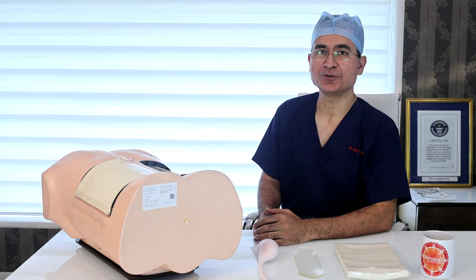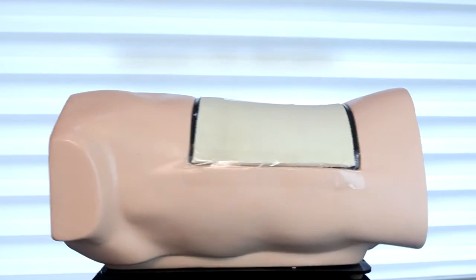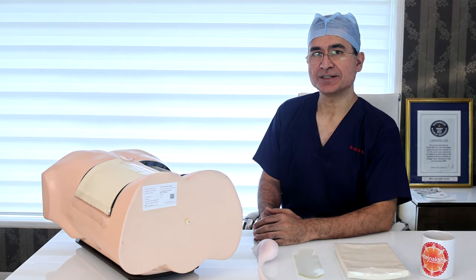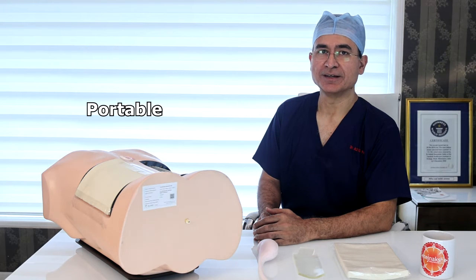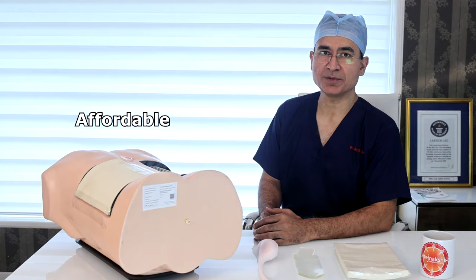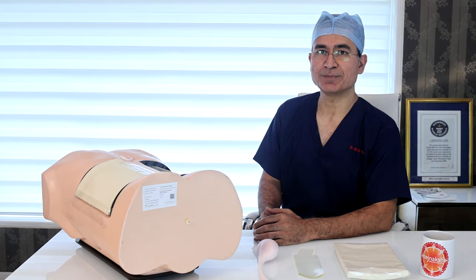Hello, we are happy to show you our personal PCNL simulator, specially developed for puncture training under fluoroscopy. The advantages of this surgical trainer is its portability. The reason why it was basically invented was to make training affordable and to make each component replaceable.